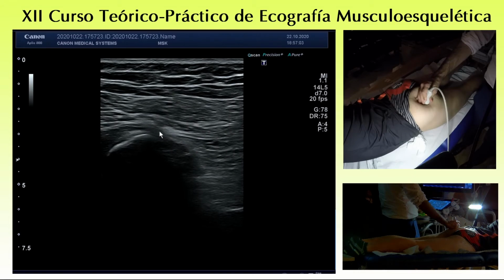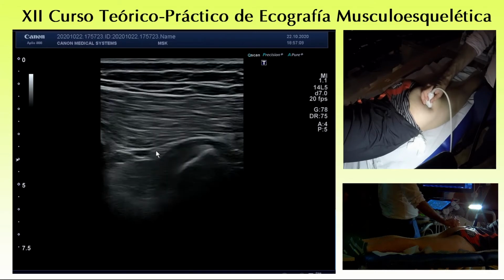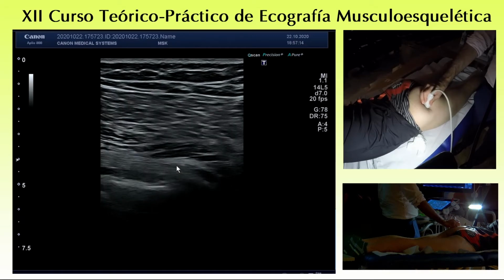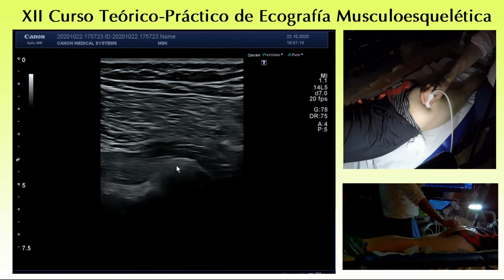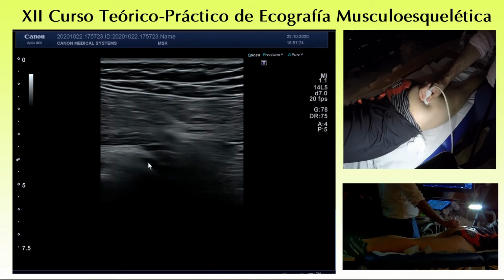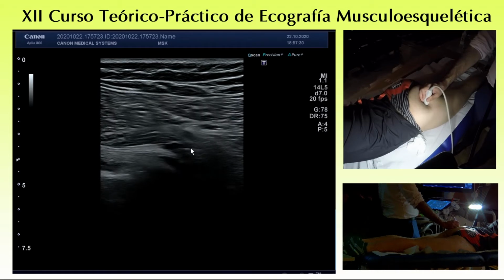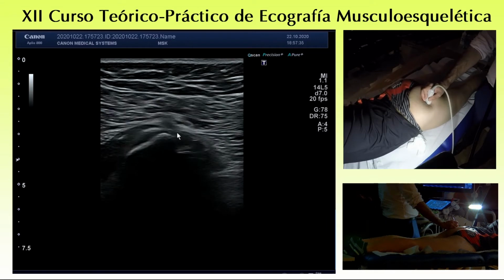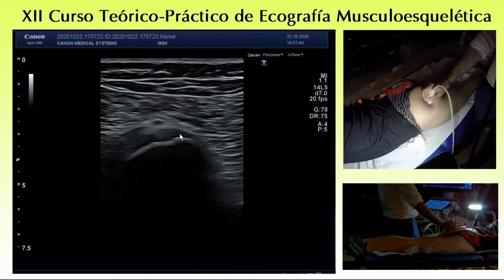Find that the big tendon is the only big tendon that is underneath the sciatic nerve, you see? Because the gemelli muscles just form a unique tendon with the obturator internus. So you check for the sciatic, find the tendon, move immediately, and look where the obturator internus muscle goes inside the pelvis, and you have the sciatic spine with the pudendal artery and pudendal nerve just here.